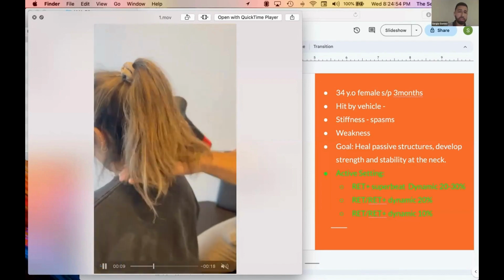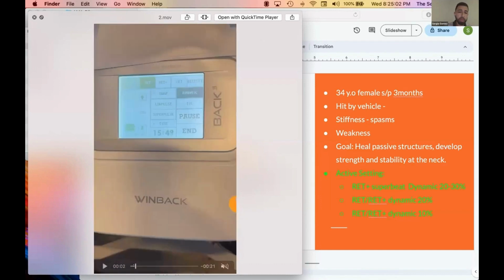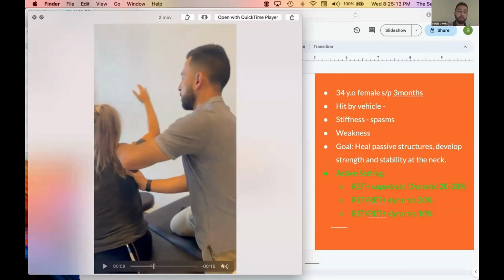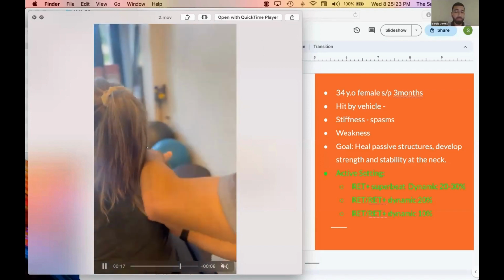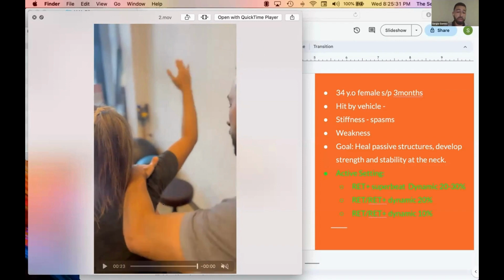So I'll give you another example here of an active setting that I utilize with her. Let's quickly go back here. Using the RET dynamic setting, again, very similar to what I had before. I'm taking her through some pec release, and including some scapular re-education at the same moment. My left hand is providing some ischemic compression on the pec minor. You can get into the scapula down here, and work at the shoulder complex, trying again to release muscle tone from the upper trap, but at the same time getting the benefits of the healing, passive circulation that's going through the cervical spine. So that's one of my favorite things about it too.